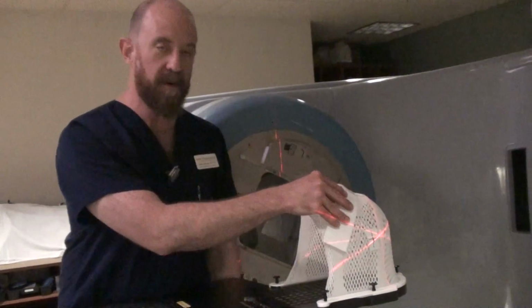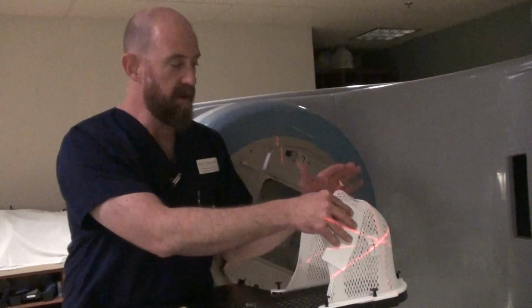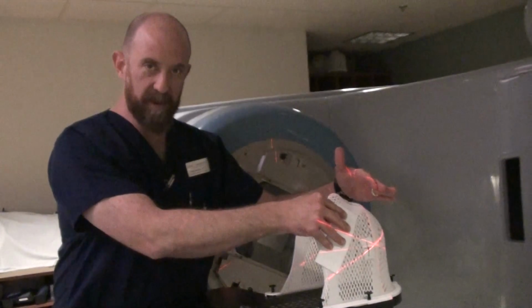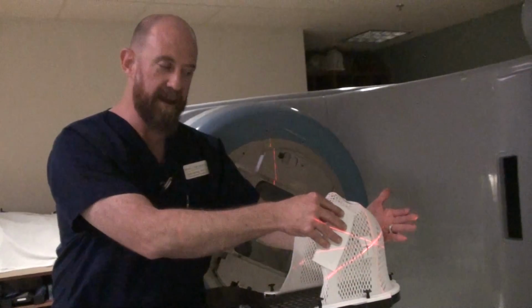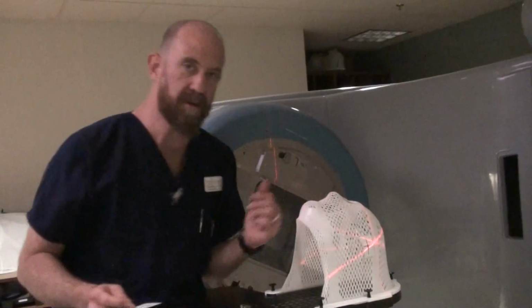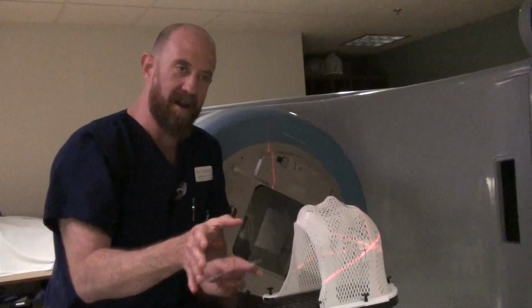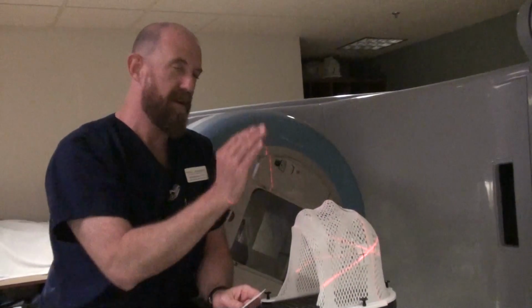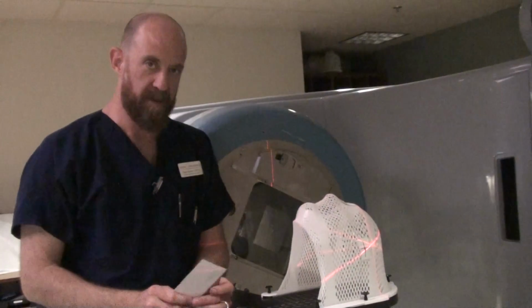For instance, your inferior border from outer canthus of the eye to the mastoid tip. Anterior border, 1 to 2 centimeters of flash. Superior border, 1 to 2 centimeters of flash. Posterior border, 1 to 2 centimeters of flash. There will be radiation going around the patient out into space, anterior, superiorly, and posteriorly.